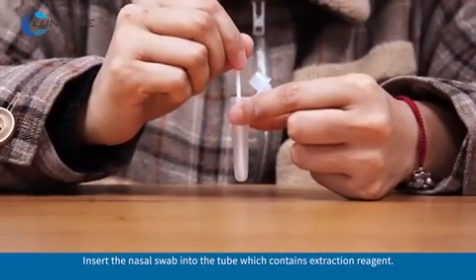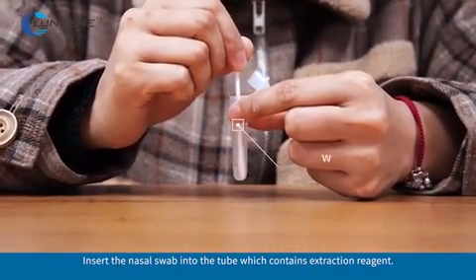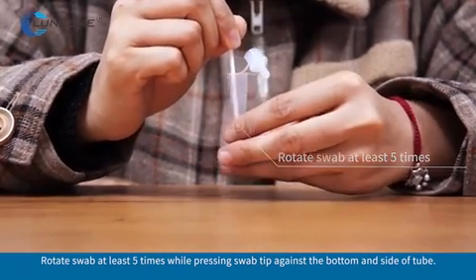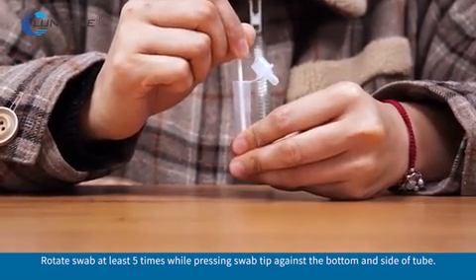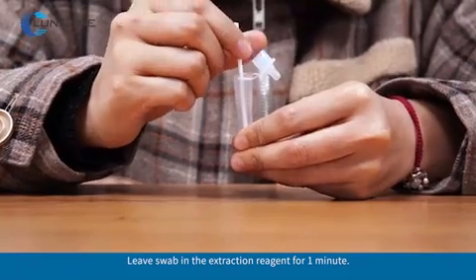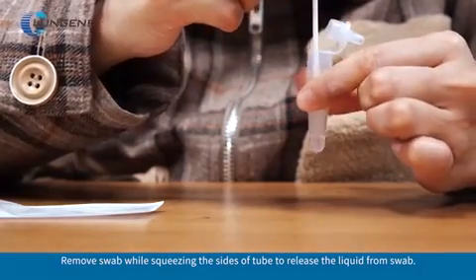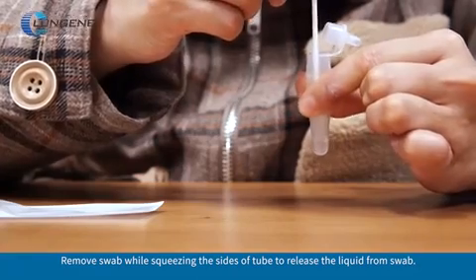Insert the nasal swab into the tube which contains extraction reagent. Rotate the swab at least 5 times while pressing the swab tip against the bottom and side of the tube. Leave the swab in the extraction reagent for 1 minute. Remove the swab while squeezing the sides of the tube to release the liquid from the swab.